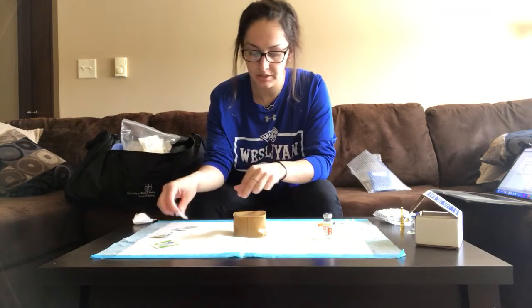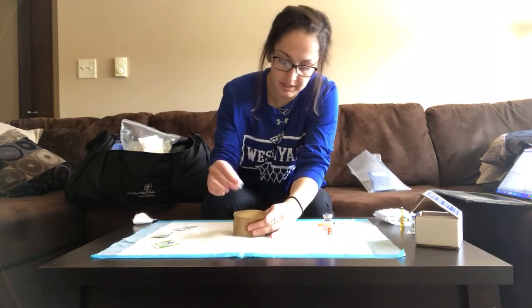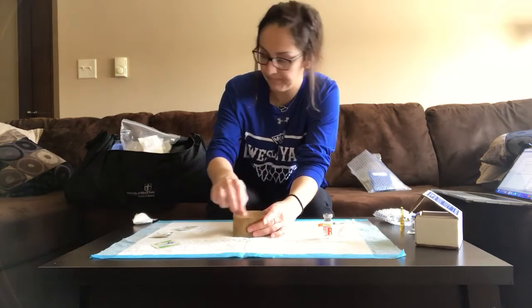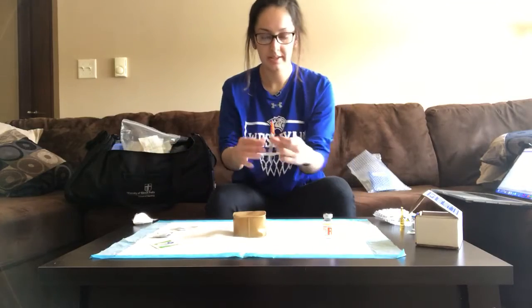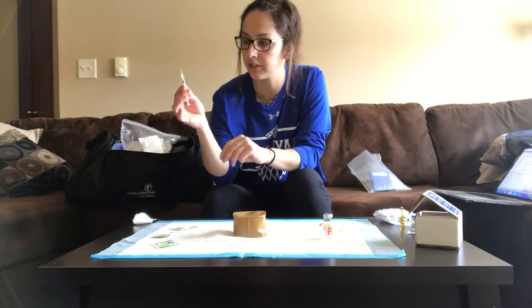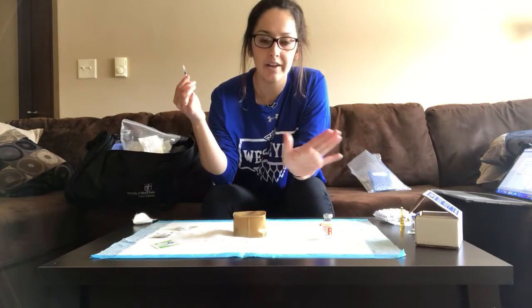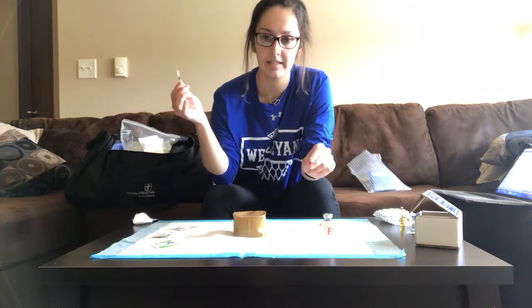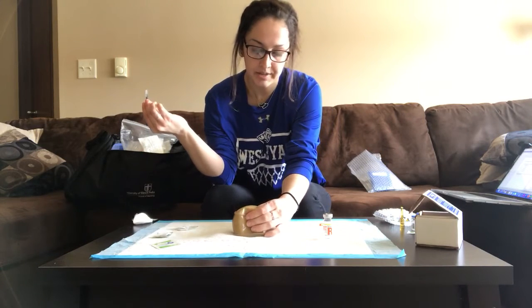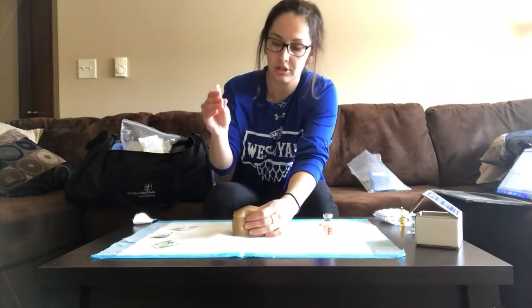And then I'm going to cleanse the patient. So I'm going to start from the middle and do 2 inches out for 15 seconds. Allow that to dry. So this is a subcutaneous type of injection. You can go in from 45 to 90 degrees, but I'm going to be going in at 90 degrees. So since I'm going to be going in at 90, I'm going to pinch 2 inches of the skin up, and then I'm going to inject the patient.